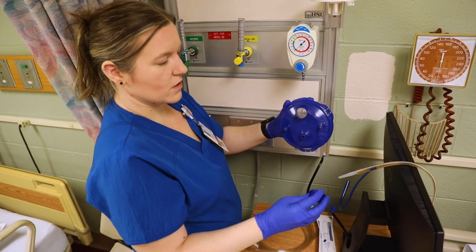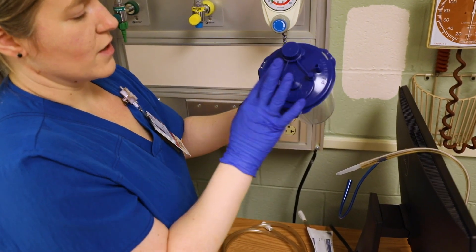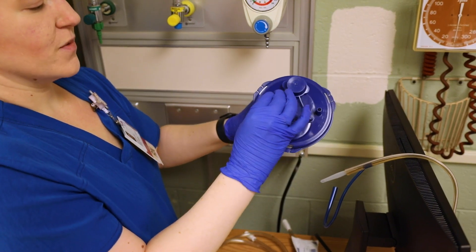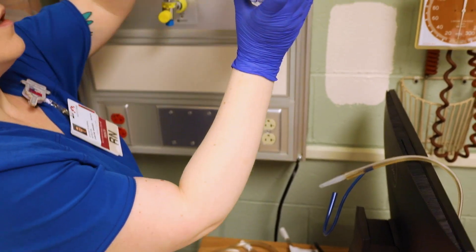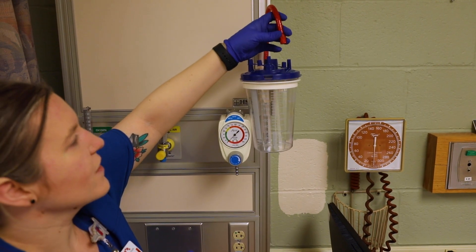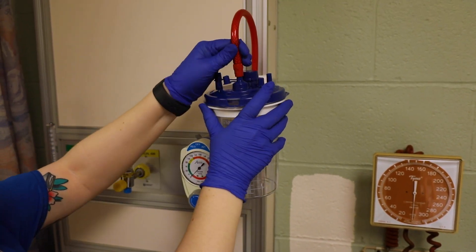There are a few different holes — you want to cap the big one like so. Now there's an ortho, vacuum, and patient port. There are three little caps. I'm going to go ahead and cap ortho because I don't need it connected to anything. For ortho, we want to slide it in here. Now this tubing right here — in the room it would connect to the vacuum, which happens to be the middle one here.